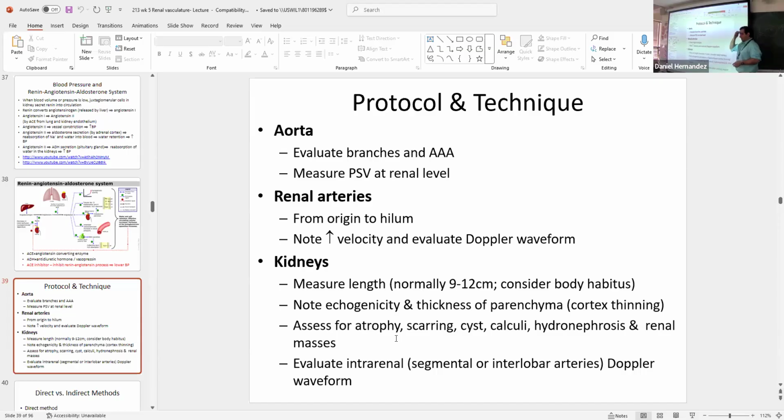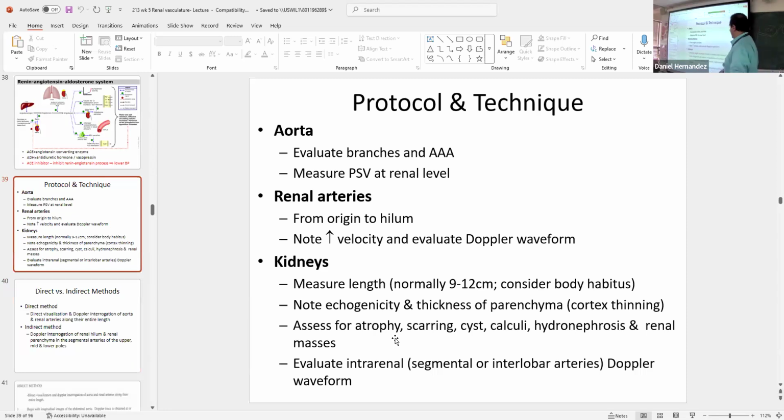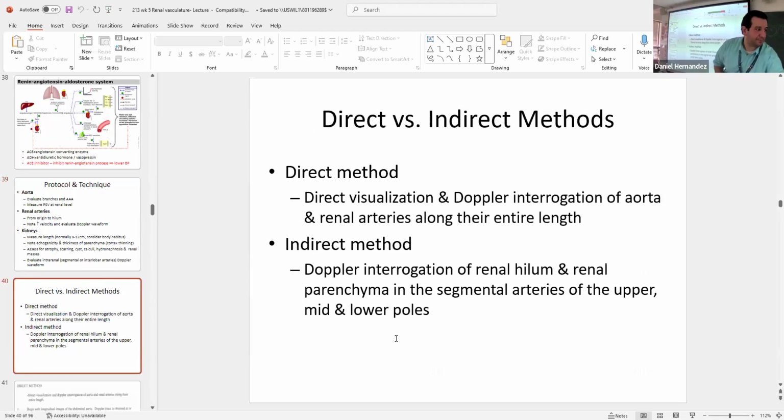Once you start doing a good number of renal artery Doppler exams or enough kidney exams, you'll notice when patients have parenchymal disease or kidney disease, they start losing flow in the cortex, and you just see flow in the center of that kidney, in the collecting system, and very poor perfusion all the way out to the borders or edges of the kidney. We'll evaluate the intrarenals at upper pole, mid pole, and lower pole, the 3 levels of the kidney, when we get into the protocol.